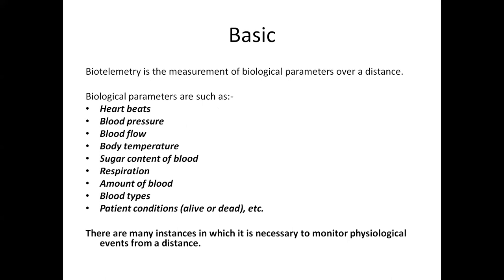Now the basic introduction to biotelemetry. Biotelemetry is the measurement of biological parameters over some distance. Why? Because at all times, the doctor or nurse may not be able to touch the patient during 24 hours. During COVID time, we saw various examples in the hospital domain. So biotelemetry is a measurement of biological parameters over a distance. A stethoscope is an example of biotelemetry to know the condition of the patient, whether the patient is alive or the heartbeat is present or not.